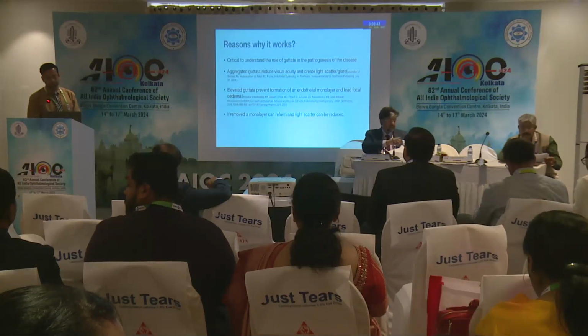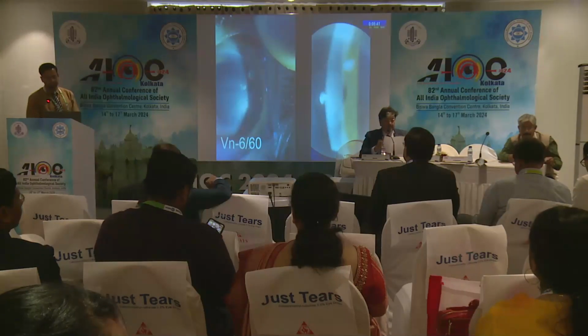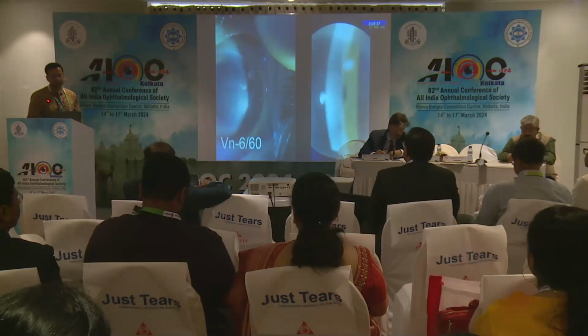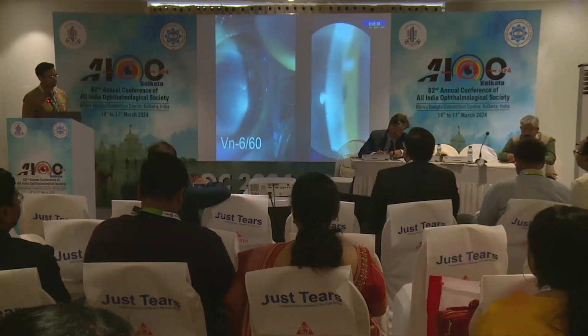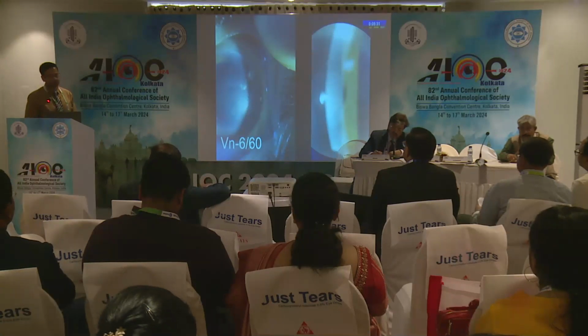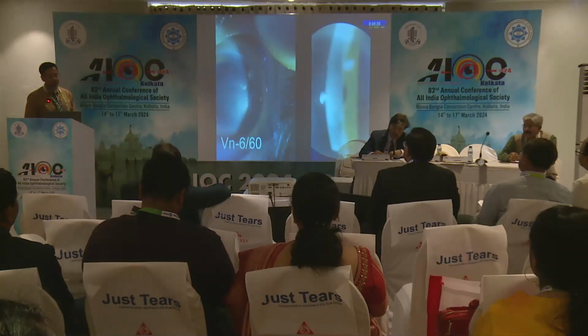Now coming to the video of the case, presenting a case of central Fuchs dystrophy in a 60-year-old female. The patient was suffering from too much glare for the last 3 years. I gave the patient the choice of DMEC and DSO, that is Descemet stripping only. The patient chose the latter.